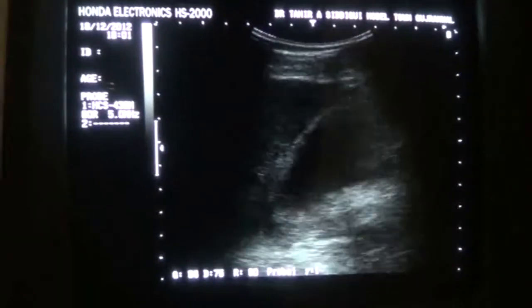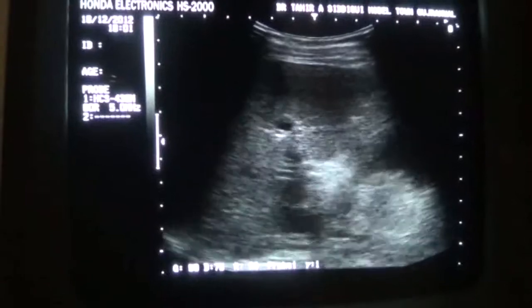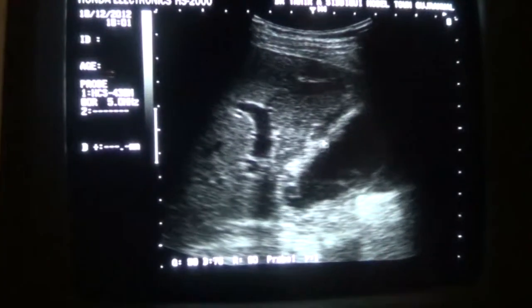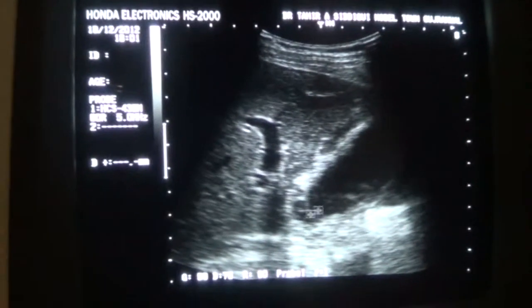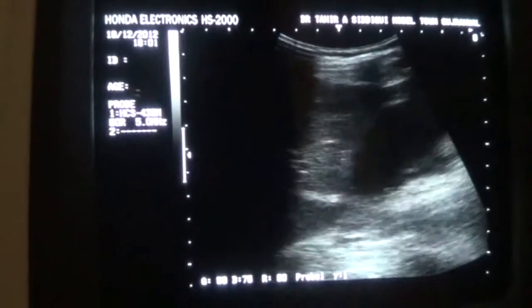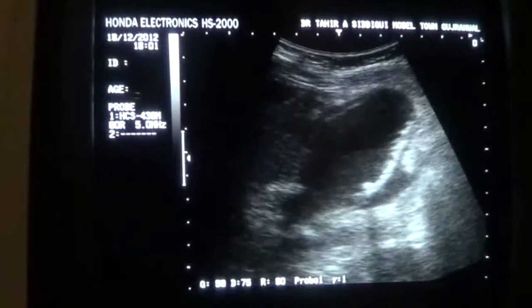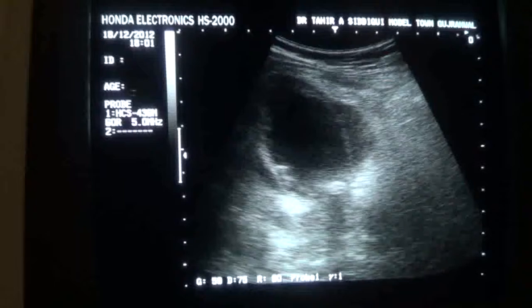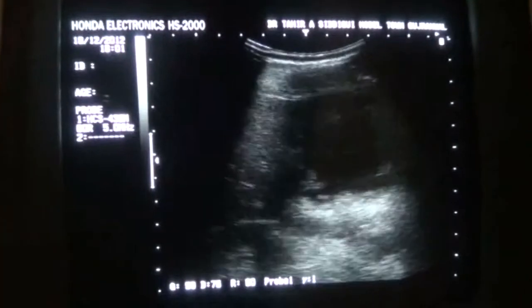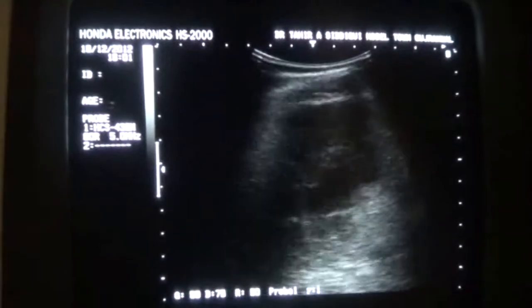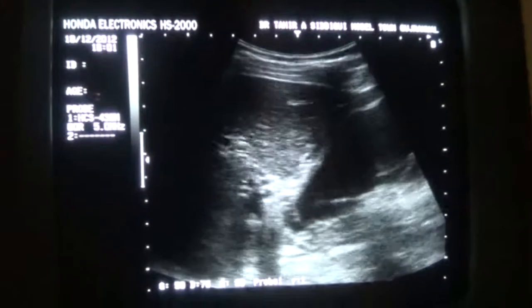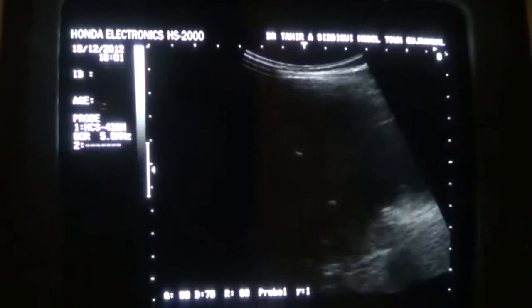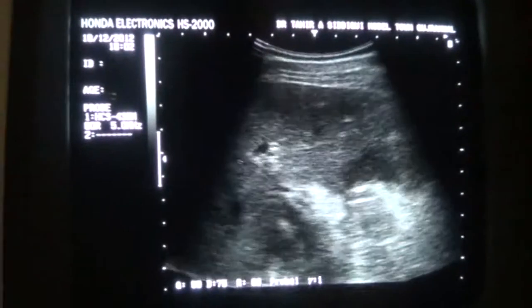This is the anterior wall of the gallbladder, this is the gallbladder lumen, and these are the calculi suspended within the gallbladder lumen. So this is a case of acute cholecystolithiasis with no dilation of the intrahepatic bile ducts. There is no evidence of obstruction. The common bile duct is not dilated.